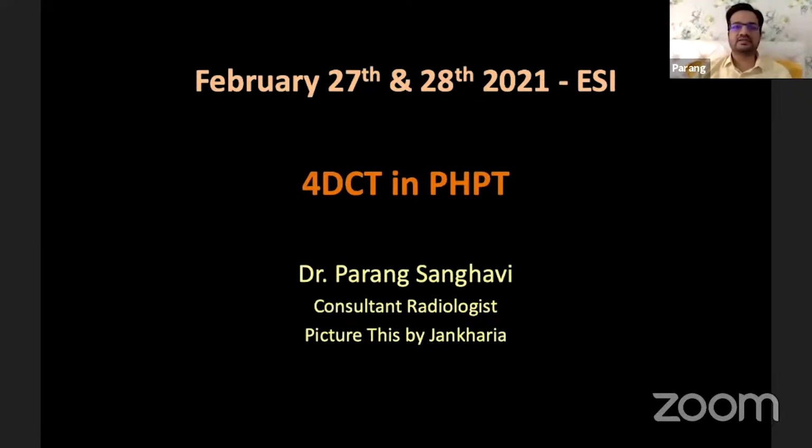Our experience and my knowledge about this latest, though not so latest now, but something new that has come up in parathyroid imaging: 4D CT, an advance in CT scan imaging, just a few modifications and a few extra knowledge, and how it accurately helps us identify and pick up the parathyroid gland so accurately and probably better than any other modality that we currently have.